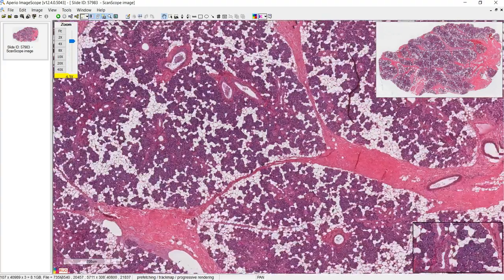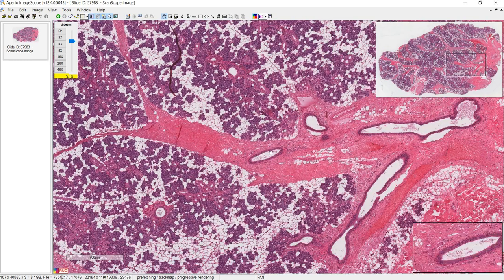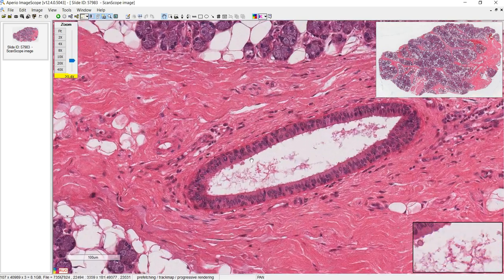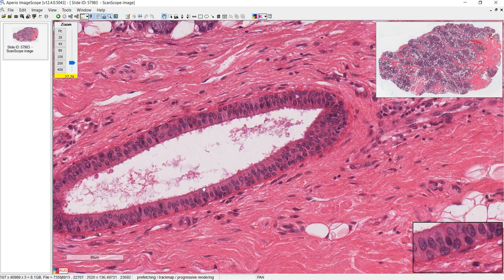All right, and another thing I wanted to point out, if you're asked to point out an interlobular duct, you want to pick something like this, right? So this is the connective tissue in between two lobules. So I would point something out like this, where you have tall columnar-looking cells, might even be stratified.